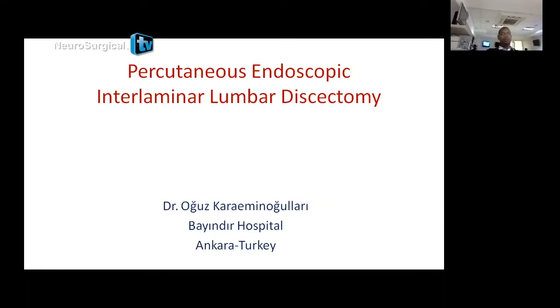The trajectory, of course, as was said, there are different schools. Dr. Gori and Dr. Lubers, who trained me, and Dr. Rutan, they all love extreme lateral. I'm going to tell you about the philosophy behind this. Dr. Fazal, do you see here now?